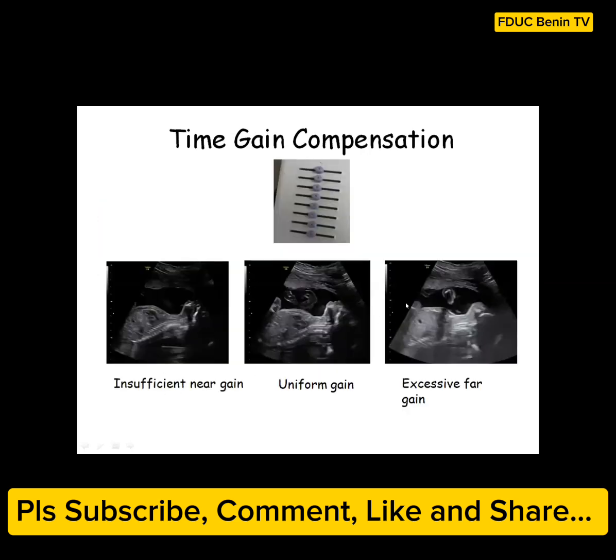So this is just putting together all that we've been talking about. This is the near gain. It's too dark. This is uniform all through, while this side, the far end, towards the deeper part, you can see is so white because the gain here is excessive.